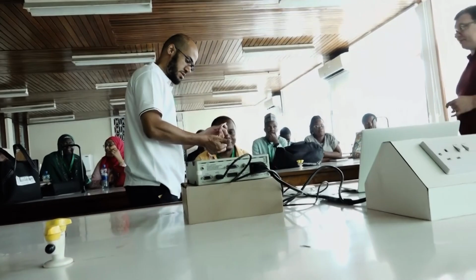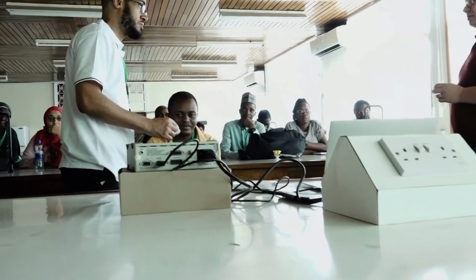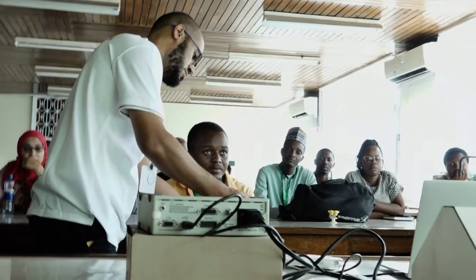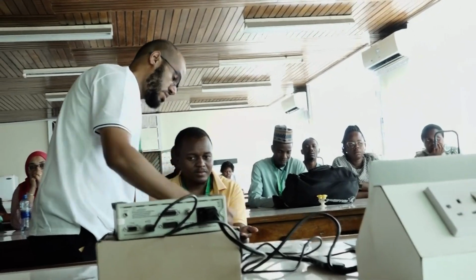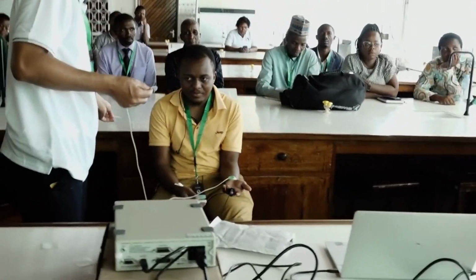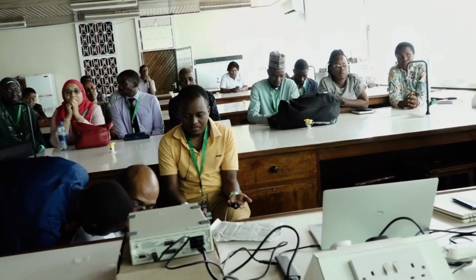Green is left. It's not following the conventional colors for ECG, where right should have been red. We also have a second channel. For the 12-lead ECG, clinically we normally use red, yellow, green. Yeah, I know it from my paramedic time. Exactly. Yeah, just the left ankle.